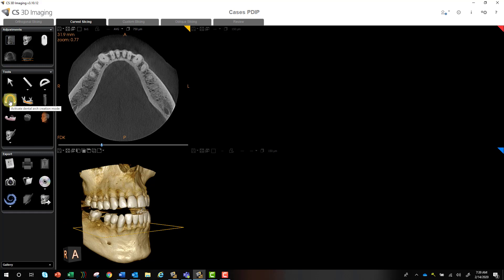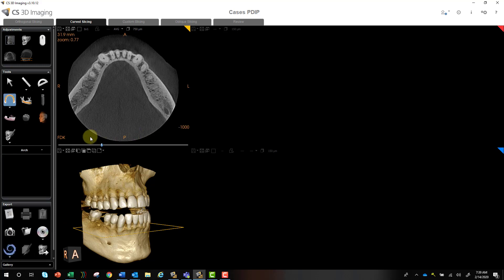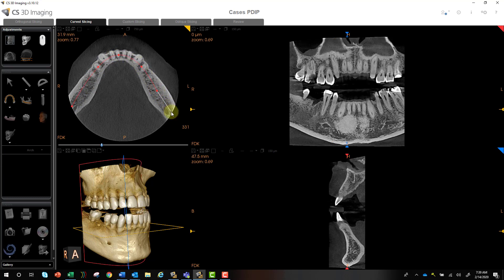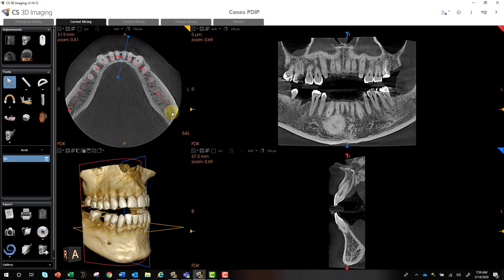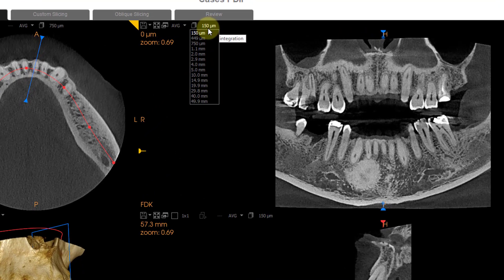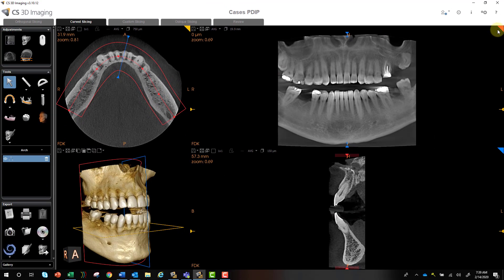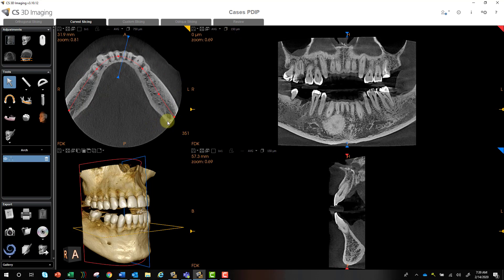We'll select our arch creation tool. There are a couple ways you can do this — I'll show you two separate ways. First, I'm going to map this down the center of the bone. Double-click. You can see in our panoramic curve we have a 150 micron slice. You can change this from a very thin slice to 20 millimeters. You can see your red line, which is my red panoramic view, and this is now 20 millimeters versus 150 microns — a very thin slice.